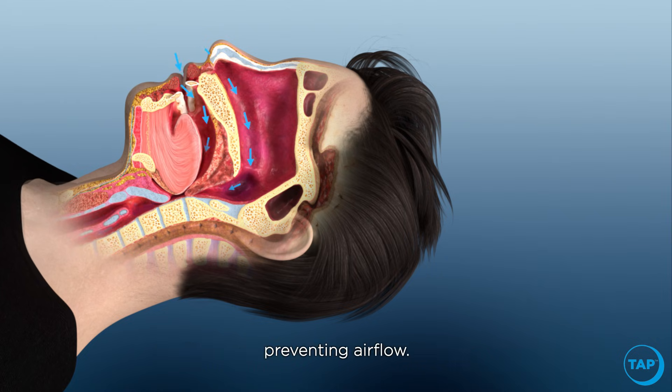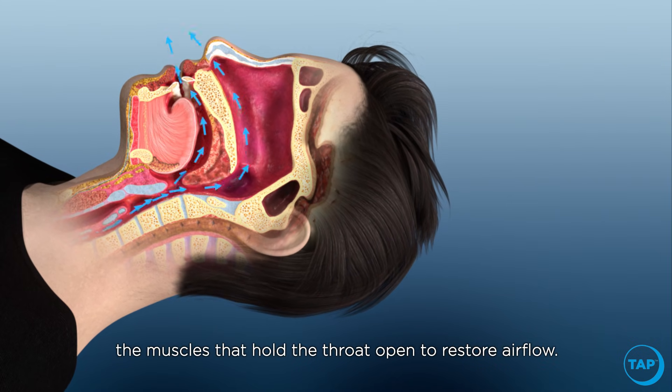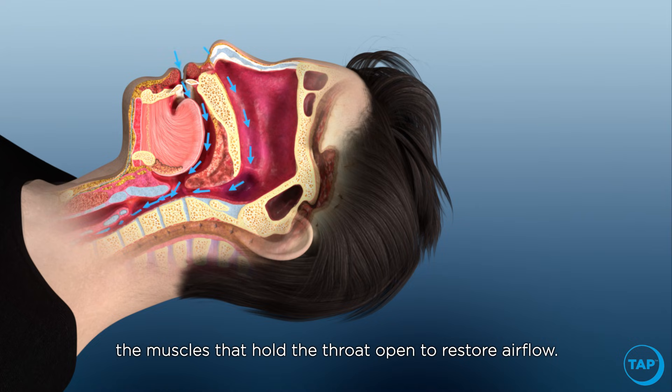The jaw rotates back and open, allowing the tongue to collapse into the airway and preventing airflow. This prompts the brain to awaken momentarily and activate the muscles that hold the throat open to restore airflow.